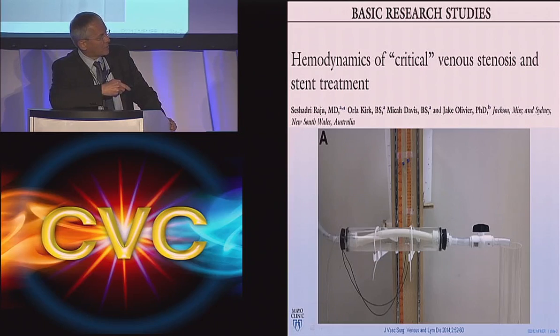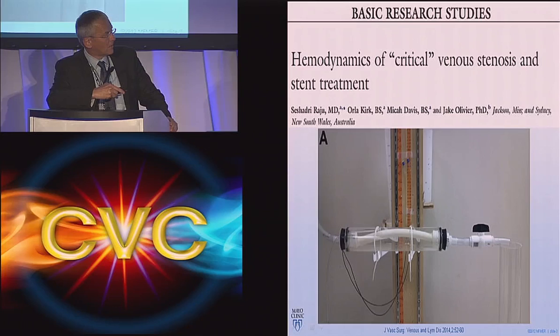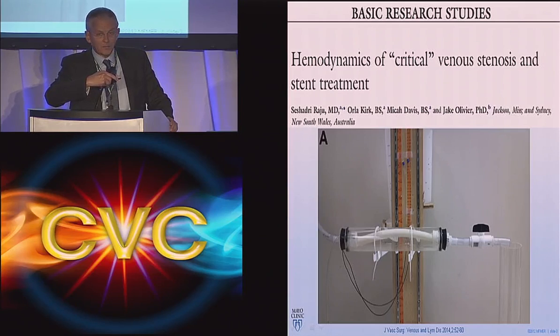By applying pressure on that rigid tube, you can actually imitate the intra-abdominal pressure. And you can also imitate an outflow stenosis here, and then at the same time calculate the pressure in the inflow vessel. And if this would be an iliac vein, this would represent the outflow stenosis in the common iliac vein. This would, not in the right order though, reflect the intra-abdominal pressure, and then they can measure the pressure here.